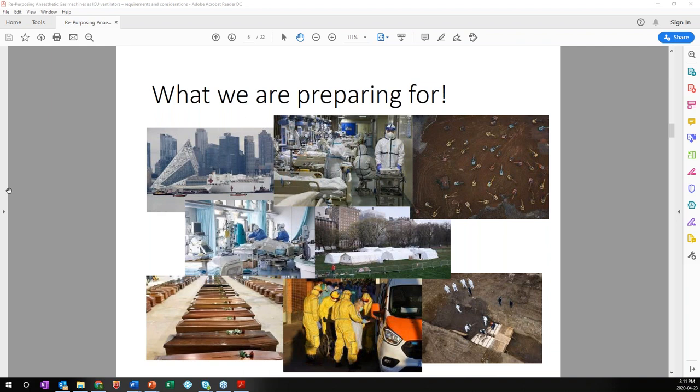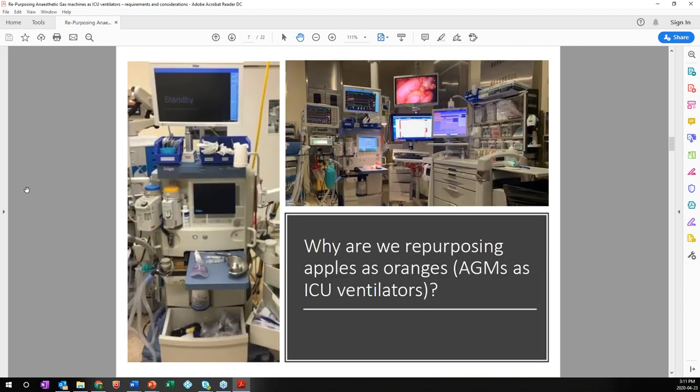So the Ministry of Health has since enhanced our emergency ventilator inventory, adding much needed capacity, but there still remains a threat that we may need to use non-ICU style ventilators in an off-label way to cope with any potential or unprecedented surge. As we saw in China, Italy, Spain, and closer to home, the United States, particularly New York, Boston, and Detroit, how quickly their hospitals and healthcare systems were overwhelmed.